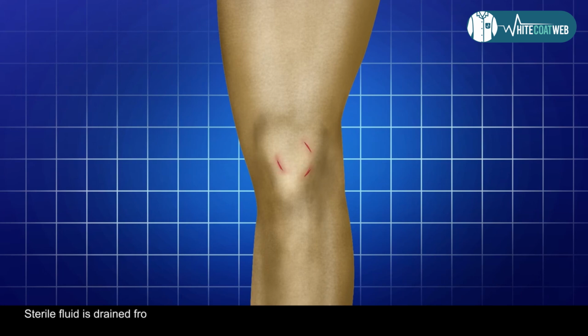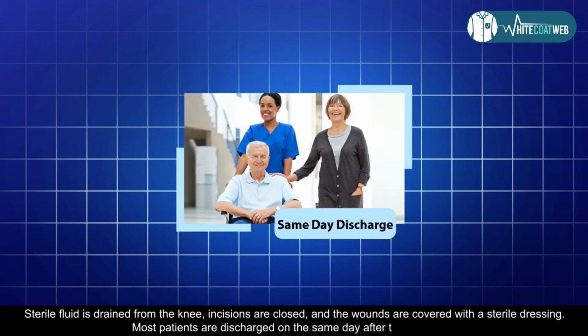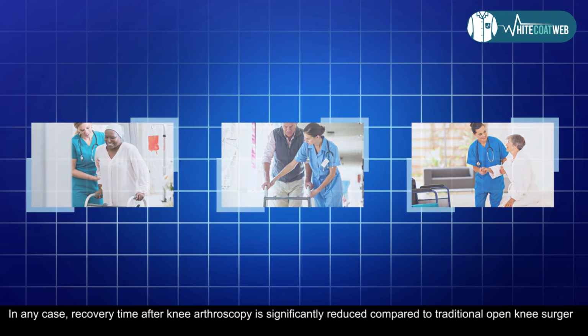Sterile fluid is drained from the knee, incisions are closed, and the wounds are covered with a sterile dressing. Most patients are discharged on the same day after the procedure. Recovery is often quick, but it depends on the type of procedure performed and the overall health of the patient. In any case, recovery time after knee arthroscopy is significantly reduced compared to traditional open knee surgery.